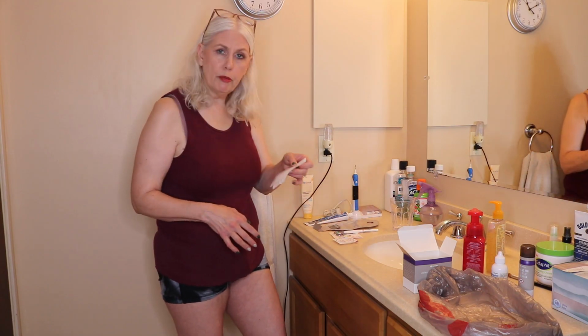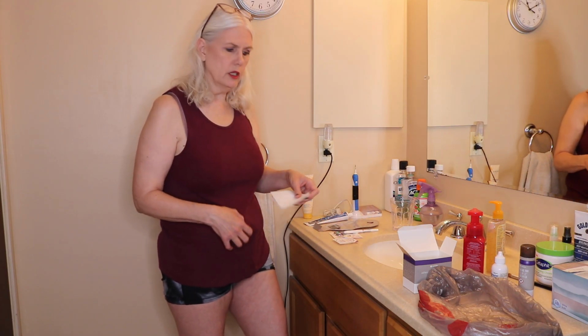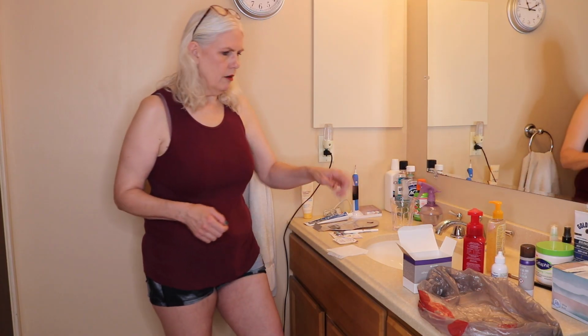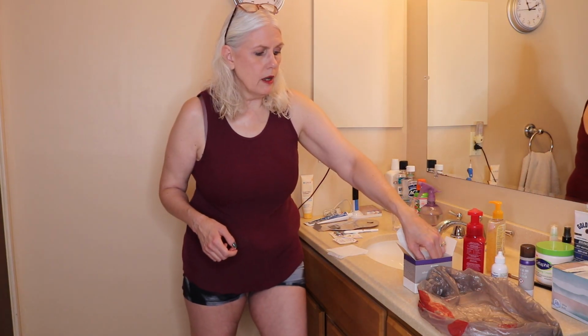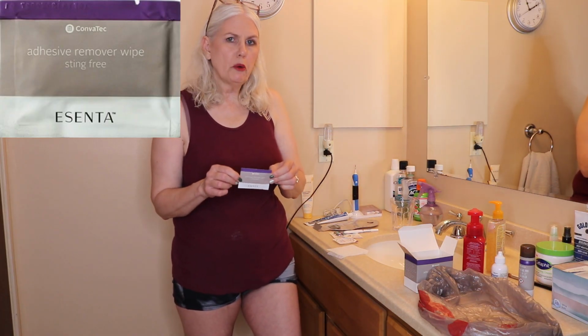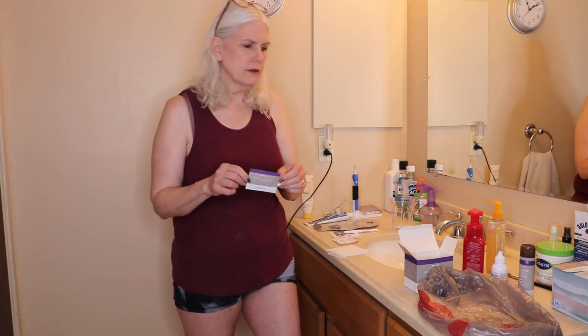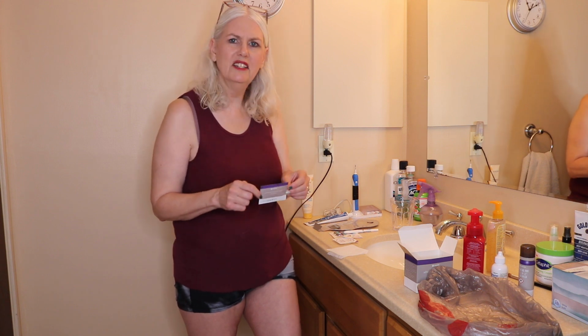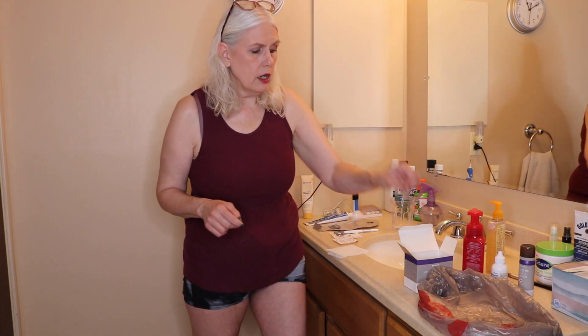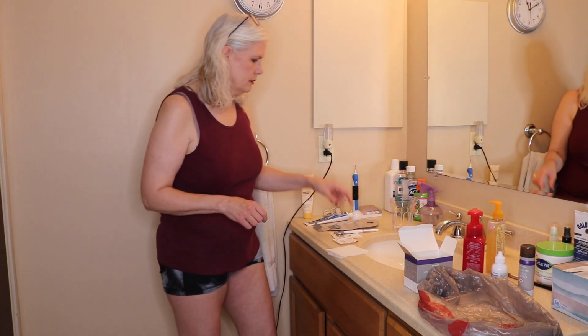I have a couple pieces of toilet paper. Usually when I take the bag off, there'll be a little bit of feces on the stoma. I can wipe that off. I have, I forgot these, adhesive remover wipes. I usually go through 3 to 4 of these. I used to go through 6 when the barrier ring was really sticking to me. So I make sure I have a bunch of those on hand.